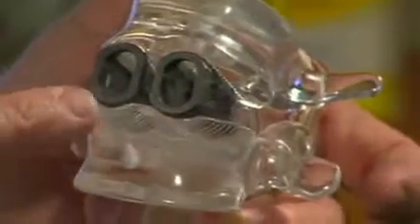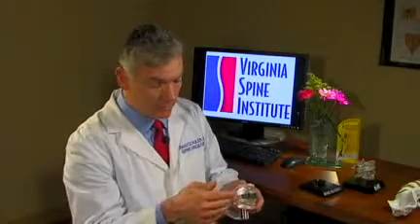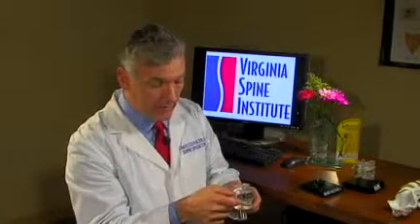Some of the modern instrumentation we would use includes little cages like this. These are lordotic titanium cages that we put in from the front of the spine. They restore lordosis — that lumbar curvature of the spine — and restore the height of the disc space.